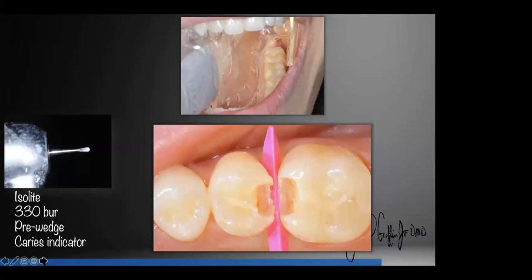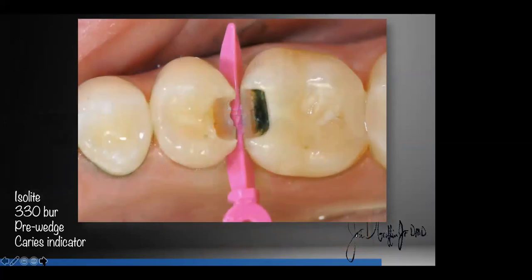In this case, we're going to do our prep with a 330 bur. I've used a new 330 bur on every restorative patient for many years — I use disposable ones. I put a wedge in before I start drilling — that's called pre-wedging. The wedge goes in before I start drilling. It protects the gum tissue, but more importantly, it pushes the teeth a little bit so I can get my matrices in easier later. So that's isolation, concept number one.